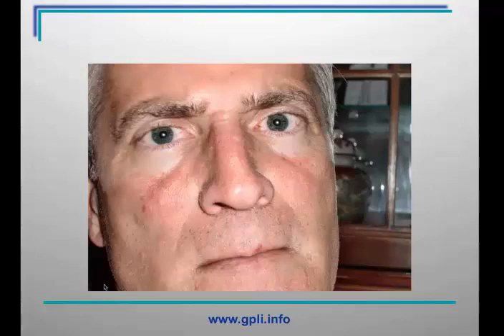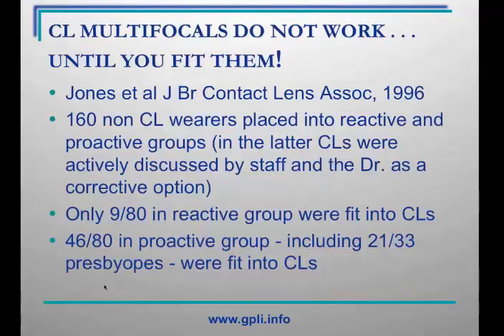So what do we do? Well, it is true. They are right. Contact lens multifocals do not work until you fit them. A great study by Jones in the Journal of the British Contact Lens Association in 1996 showed that they took 160 non-contact lens wearers coming into their office and randomly placed them into two different groups.